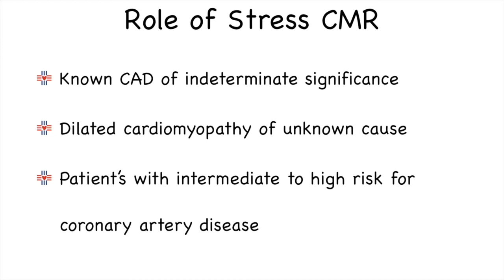It is also useful in patients who have intermediate to high risk for coronary artery disease and are being tested for it. So, for example, if a 70-year-old diabetic and hypertensive walks in with stable chest pain or atypical symptoms, rather than getting an invasive catheter angiography in this patient, it may be better to do a stress cardiac MR and decide further management of the patient based on the findings of the stress MRI.